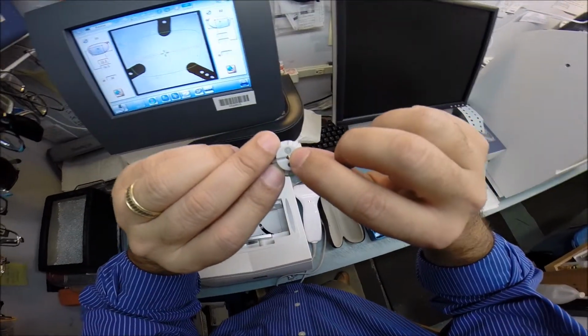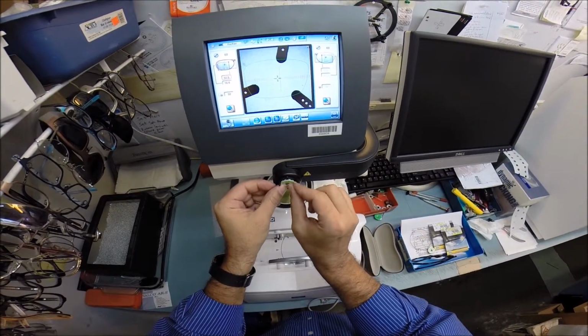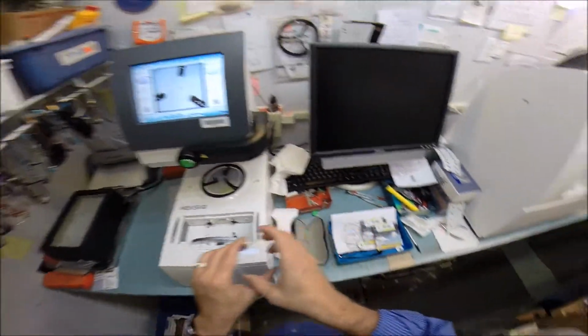This little silver tab is a magnet. I'm going to put that there. It's going to hold it in place. I'm going to peel away the sticker. The green side is the sticky side. I'm going to take your right lens.